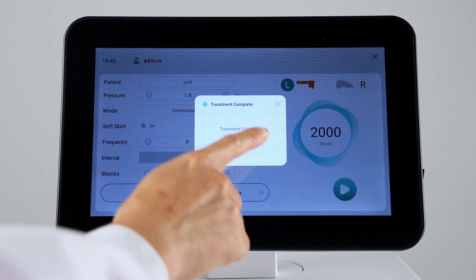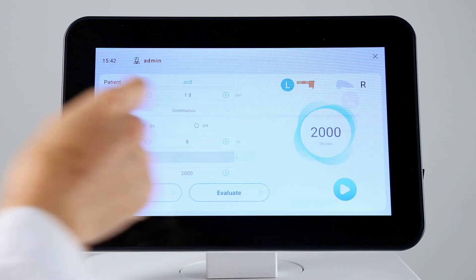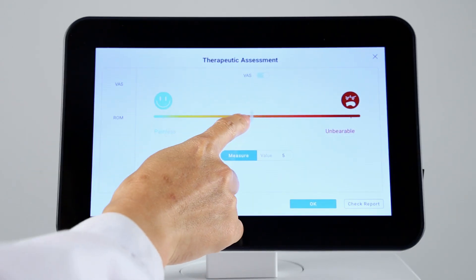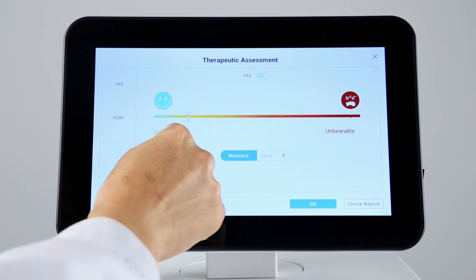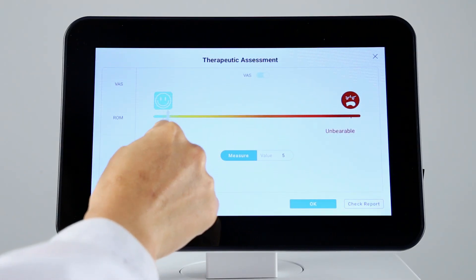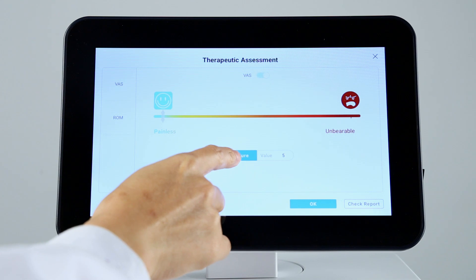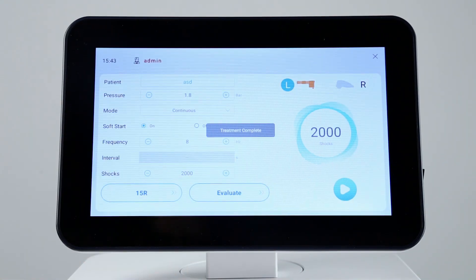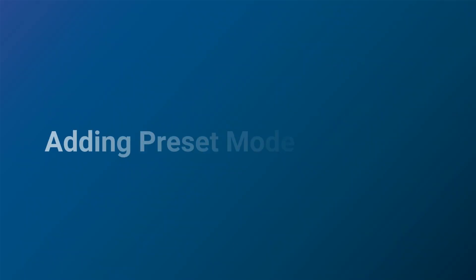After treatment, you can measure the pain and mobility conditions of patient to compare with the pre-treatment. Above is the operation process of preset mode.